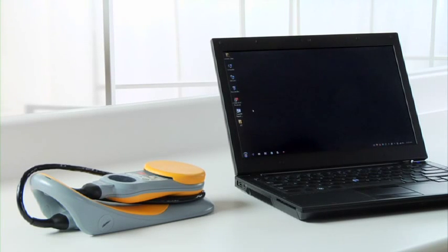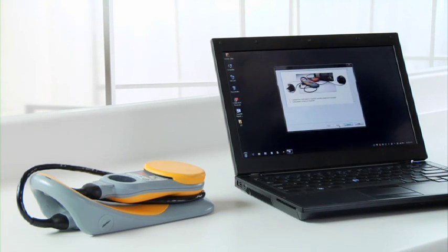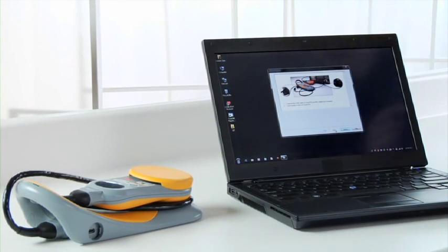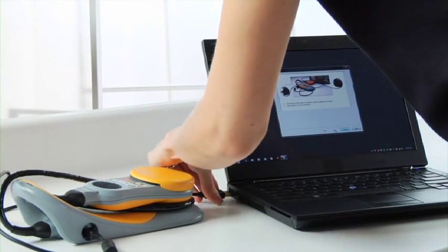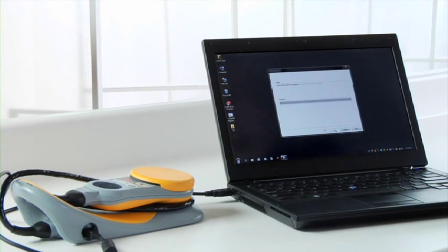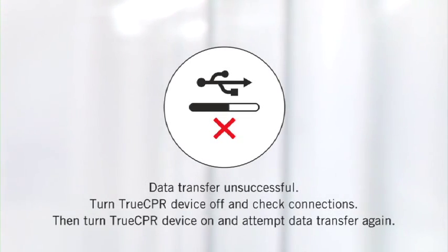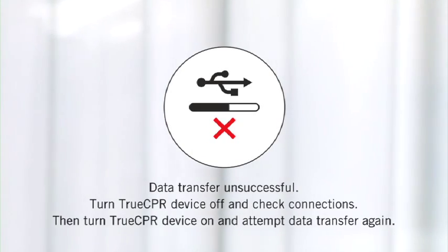The second way to review data is by downloading it to a computer, where you can review and print reports in much greater detail. Start with TrueCPR turned off, then connect the USB cable to a computer with compatible software — be sure to only use a USB cable that meets the specifications outlined in the instructions for use. Turn on TrueCPR and follow the instructions on the computer screen. If the device memory is full, the data transfer can take up to five minutes. The device will display 'data transfer in progress' and then 'data transfer successful.' If the transfer is not successful, turn TrueCPR off, check connections, turn it back on, and attempt the transfer again. If the problem persists, call technical support.